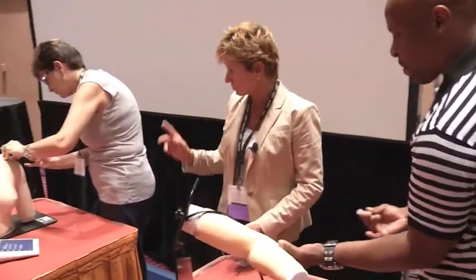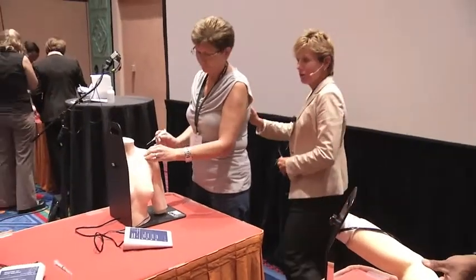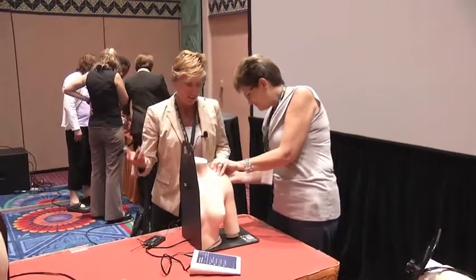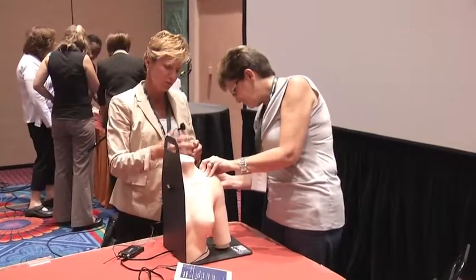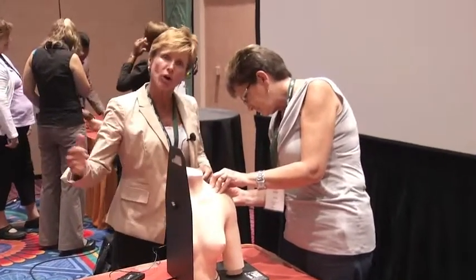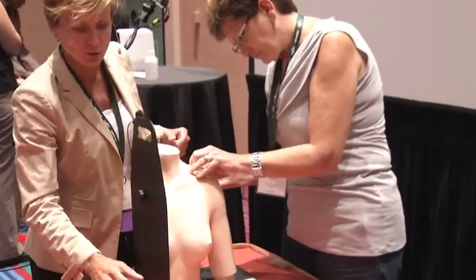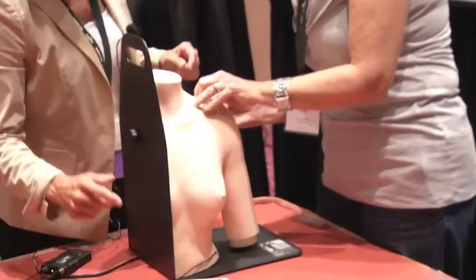Same over here with the shoulders. What we're practicing here with the shoulder is doing subacromial injections. She's had the lectures, she's learned how to do it, she's looking for correct finger placement. She's done her shoulder exam, she wants to inject the subacromial space, so now she's put her needle in and it's not lighting up correctly.